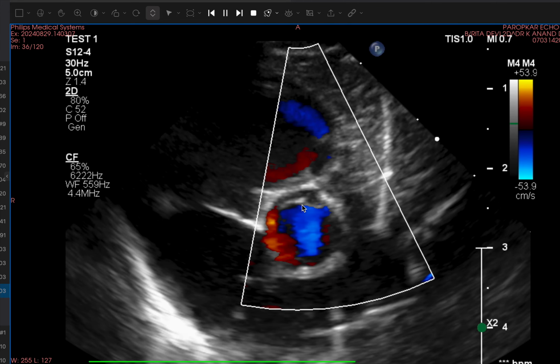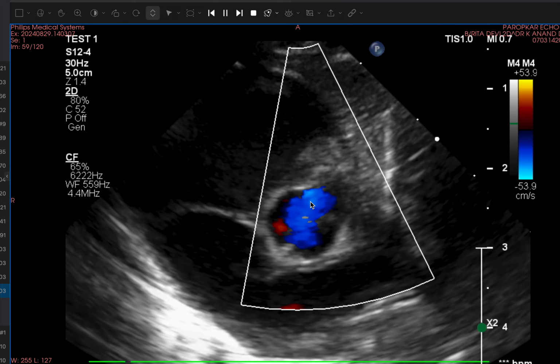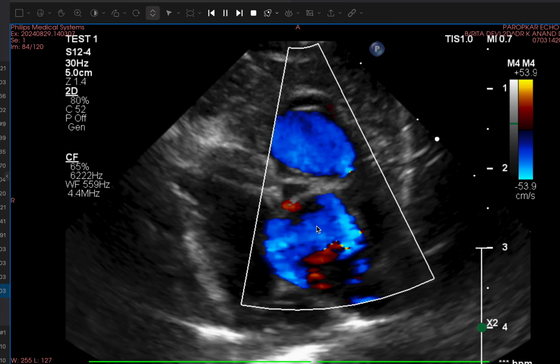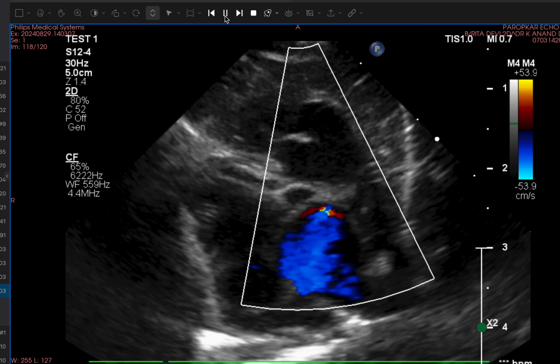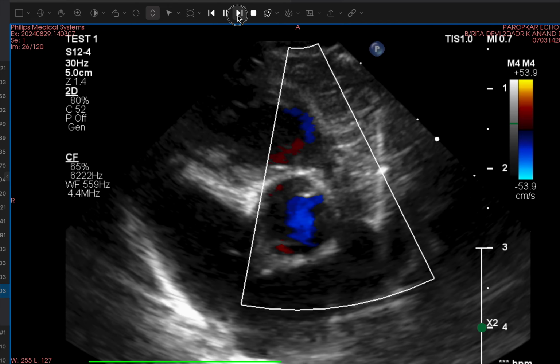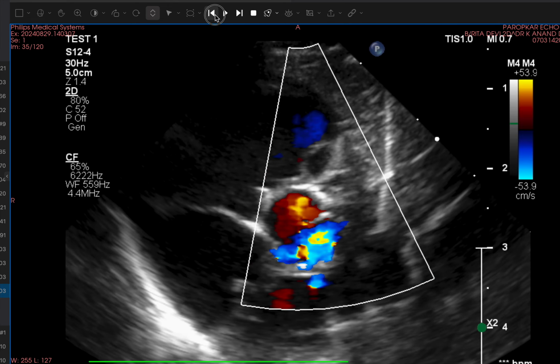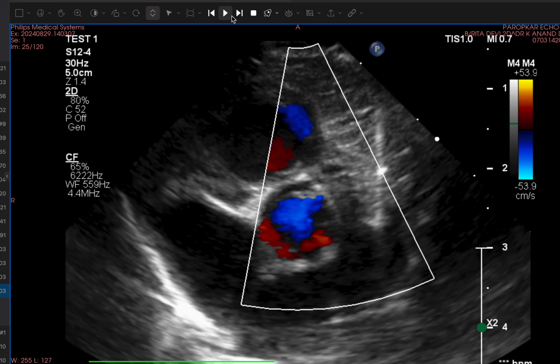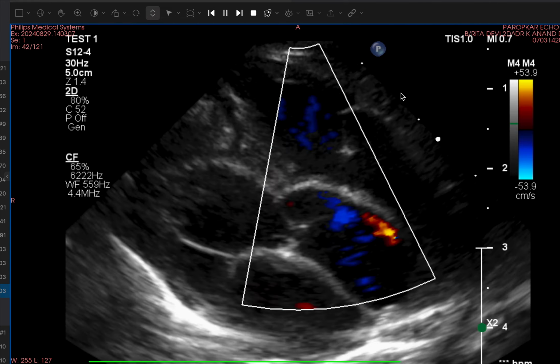This is again the parasternal short axis view. This is pulmonary artery. You can see the pulmonary artery is bicuspid in nature. You see in this image, I will try to show you pulmonary artery bicuspid nature. Pulmonary artery bicuspid nature, and that is the point.